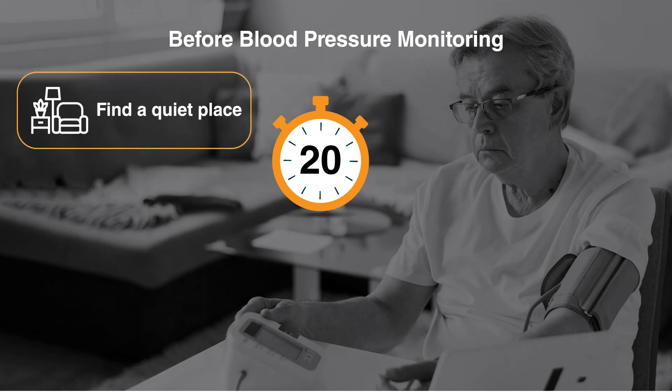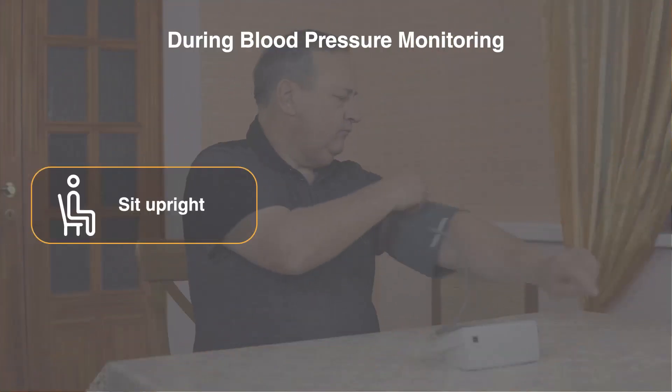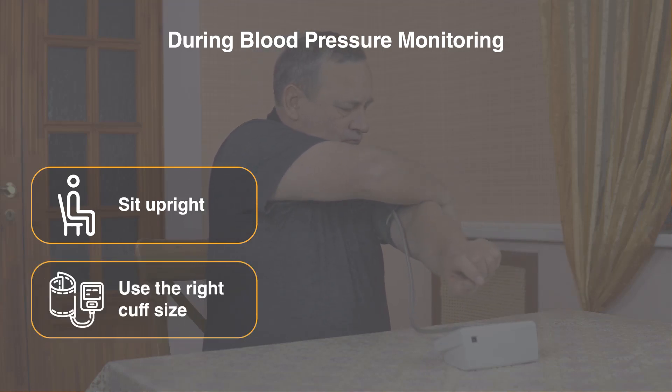Find a quiet place, sit still, and relax for five minutes before checking your blood pressure. Sit upright with your back straight and feet flat on the floor. Use the right cuff size.